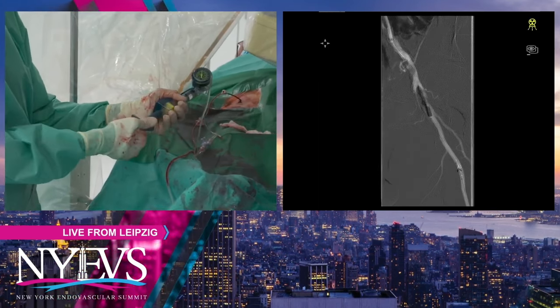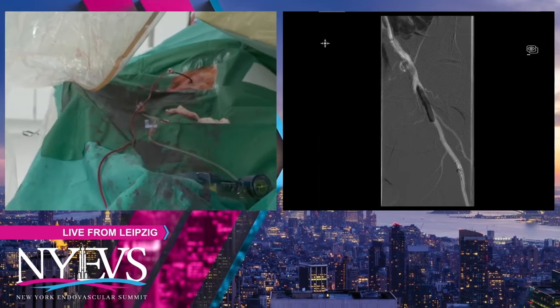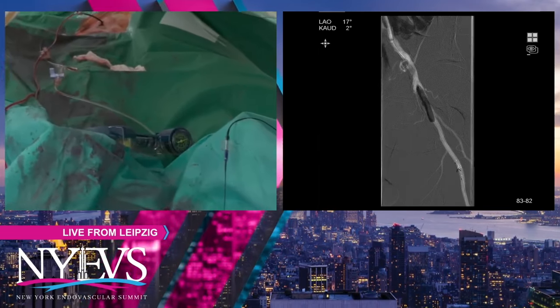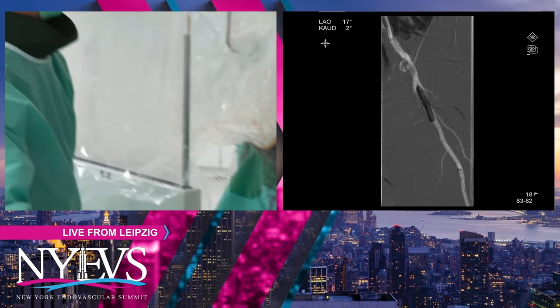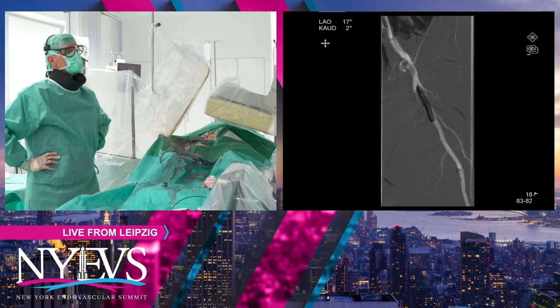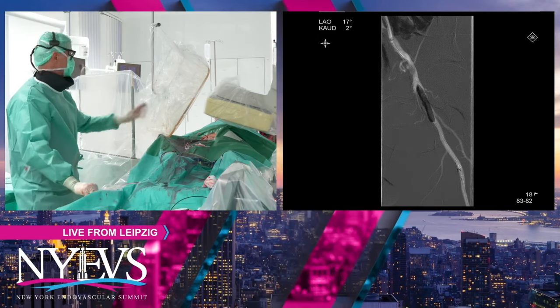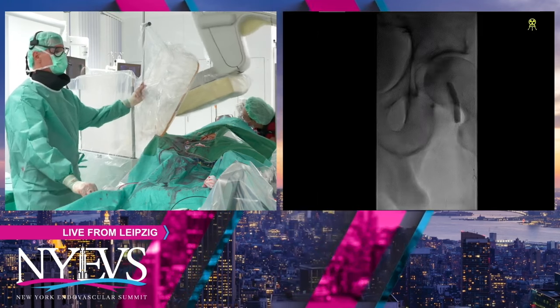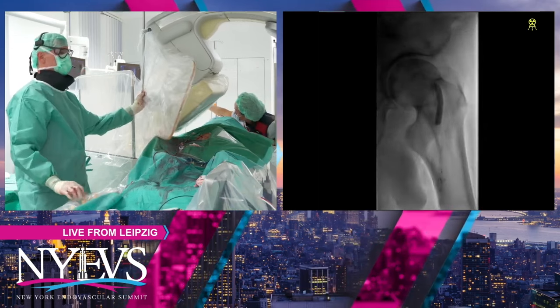Yeah, please. A couple of comments. One is if your filter is completely blocked, and sometimes you see the column of dye stops a few centimeters above the filter, if you just try to use usual filter retrieval, that's not going to be a good idea.